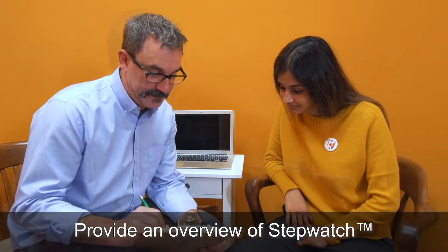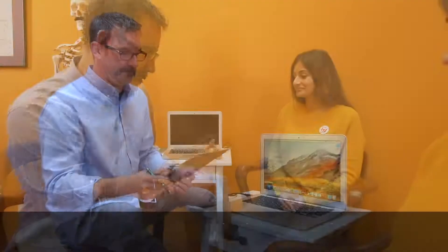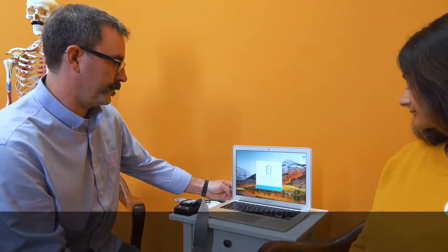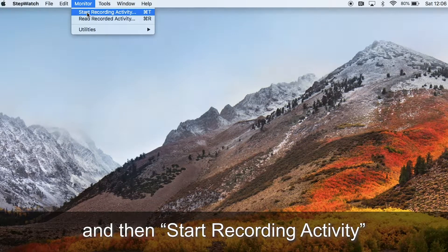Provide an overview of StepWatch and obtain consent from the patient to wear a StepWatch Activity Monitor. Set the StepWatch in the DOC and open the software. From the menu options, select Monitor and then Start Recording Activity.